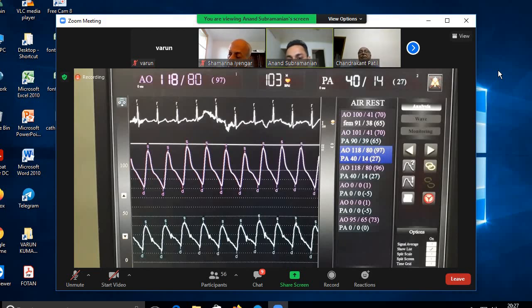And here it's literally fallen to 1/3 of the aortic pressure. Now, coming to your second question of pulmonary edema, what happens in most of these PDAs when you suddenly occlude this, you have a large runoff from the aorta into the PA. Now, when you suddenly occlude the PDA, this aortic runoff is gone. So that leads to an increase in the aortic diastolic pressure and the aortic systolic pressure.